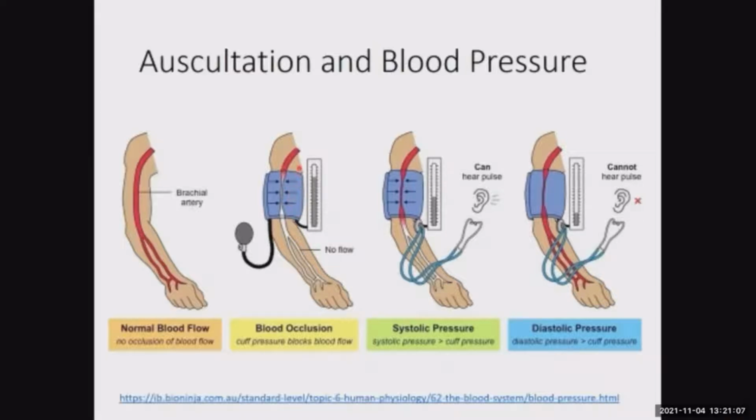Now, when the artery is completely collapsed in this situation, the blood pressure cuff is at a high pressure. We're squeezing it completely, so that when we are listening for a sound below, or more distal to where the blood pressure cuff is located, we're not going to hear any sound, because there's no blood flowing through the blood vessels or arteries at that period of time.